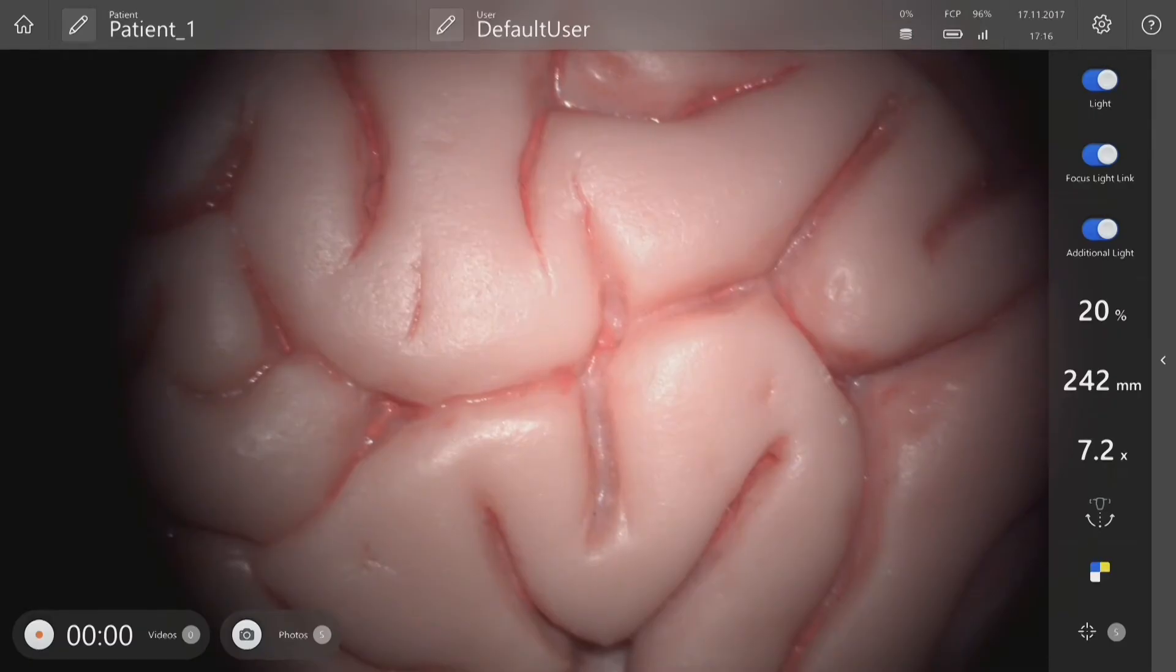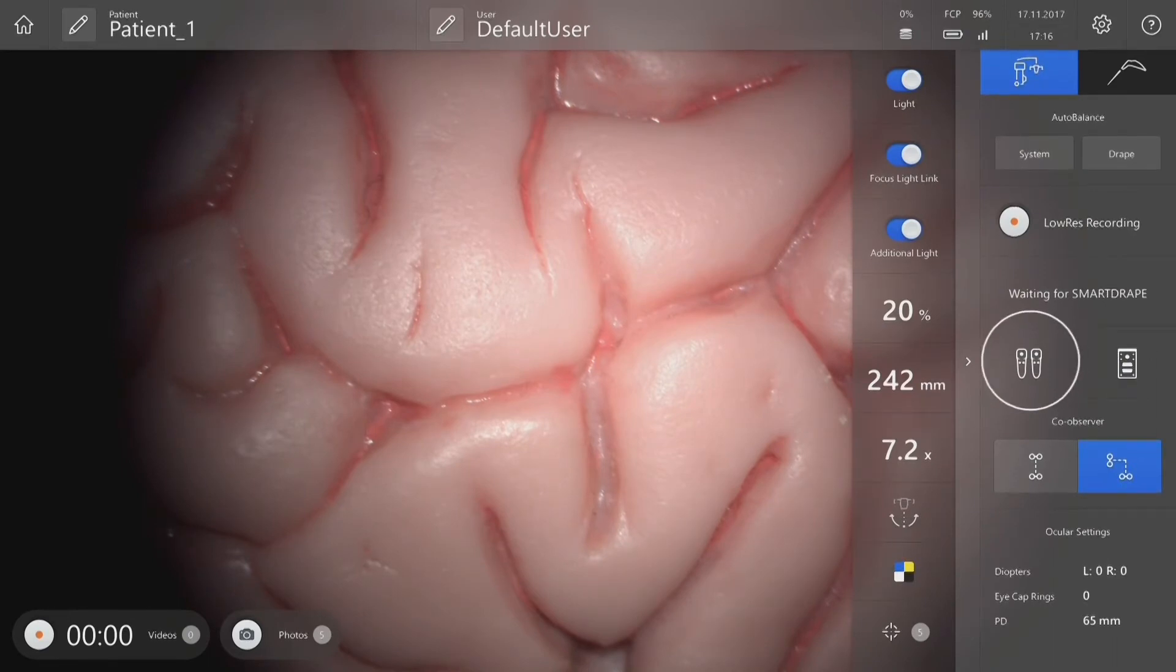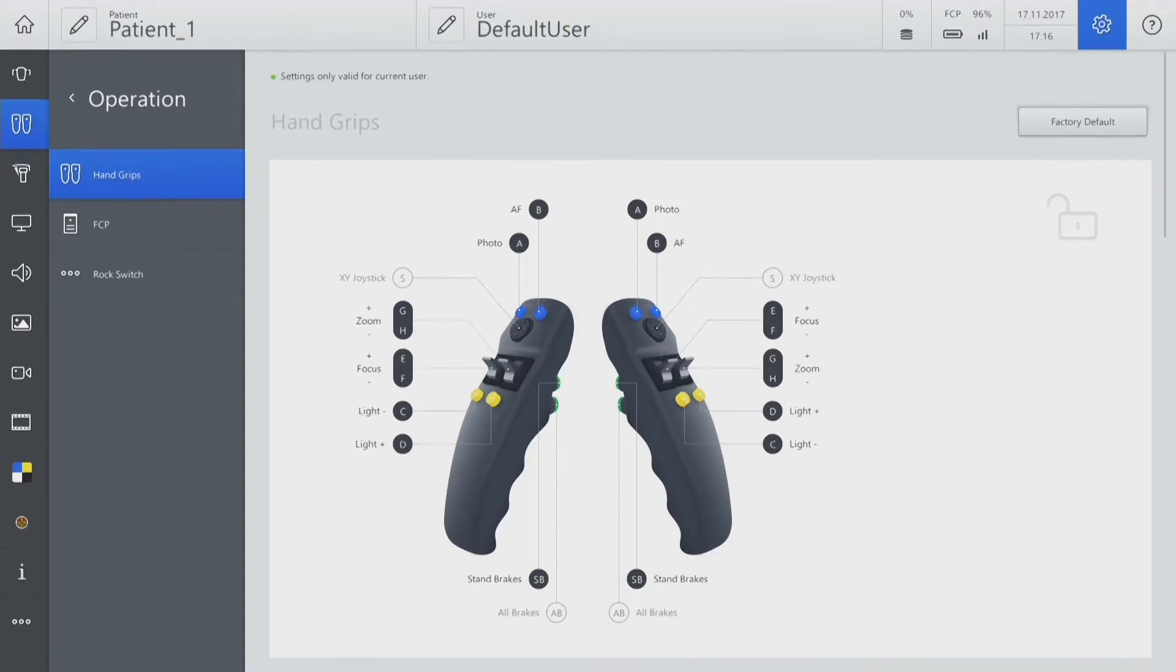One of the buttons on the handgrip can be configured for position memory. Open the handgrip icon on the main screen, go to Adjust Settings, and configure position memory to one of the top blue buttons on the handgrip.